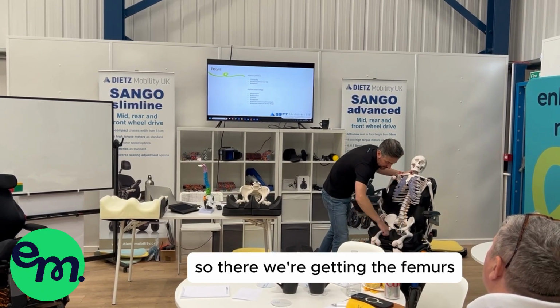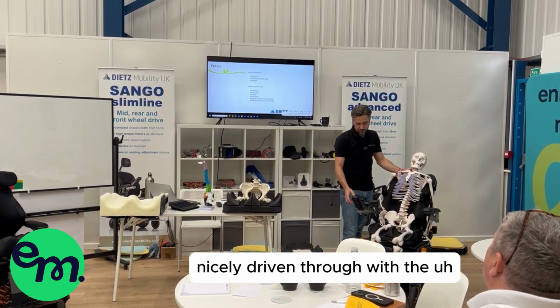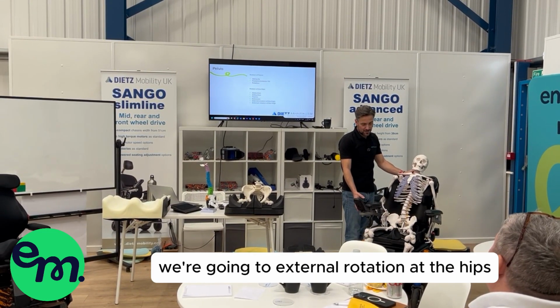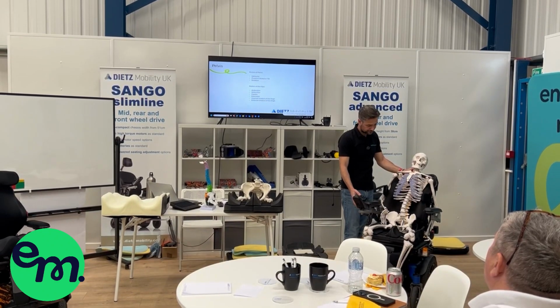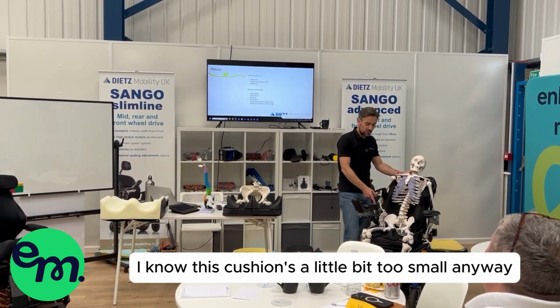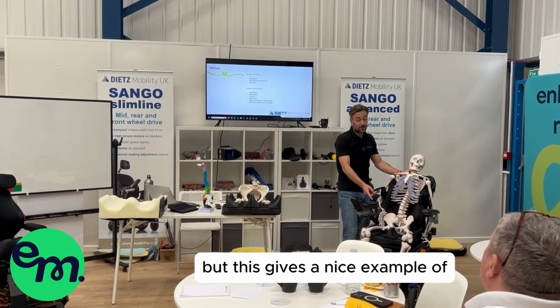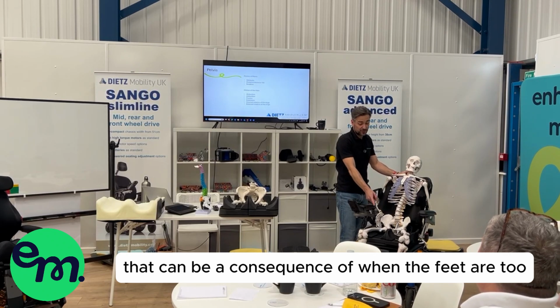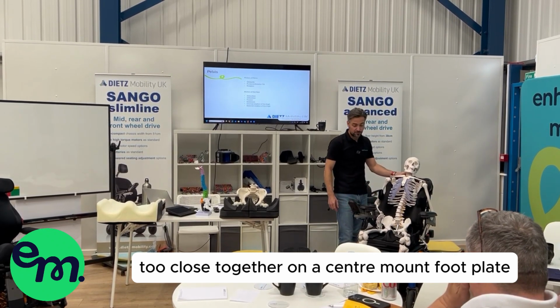So there we get the femurs nicely driven through the femoral channels in the cushion, and then as we raise up, we go into external rotation of the hips. I know this cushion is a little bit too small anyway, but this gives a nice example of what external rotation is, and particularly that can be a consequence of when the feet are too close together on a centre-mount foot plate.